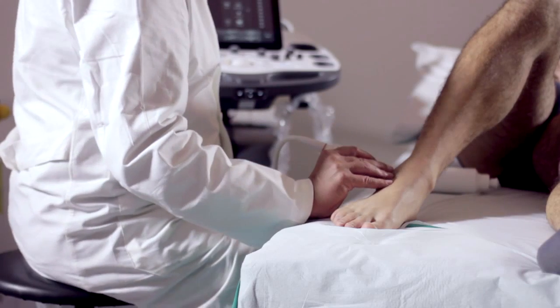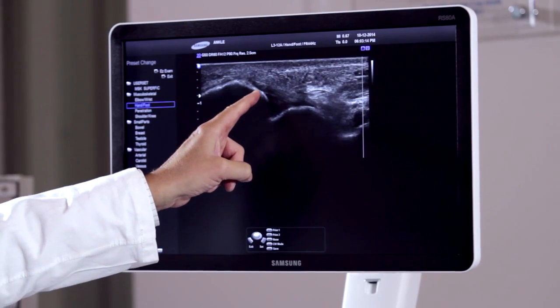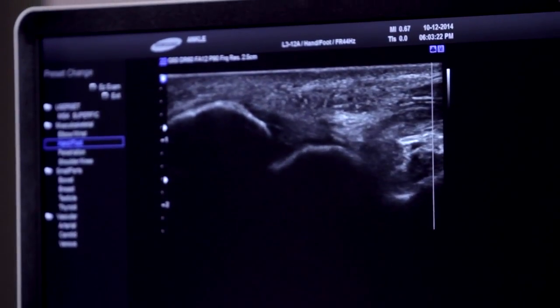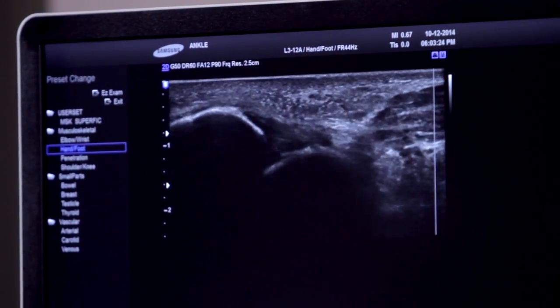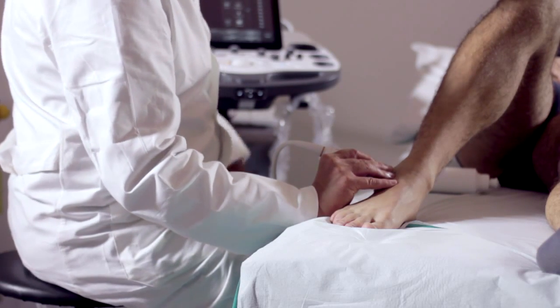that are formed by the anterior talofibular ligament. This is a scan along the major axis of this ligament. It can be seen as a structure stretched between the lower edge or apex of the lateral malleolus and the most lateral surface of the talus. This is a very thin ligament of 2 or 3 millimeters, and we must therefore be very careful to make small movements of the probe to view it properly.